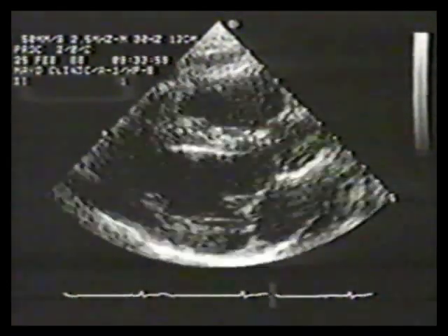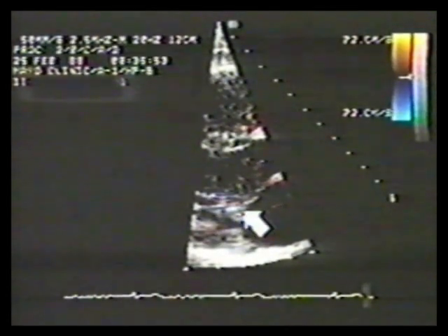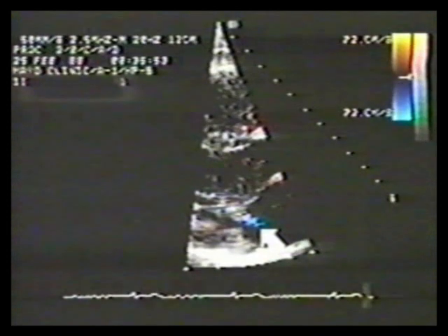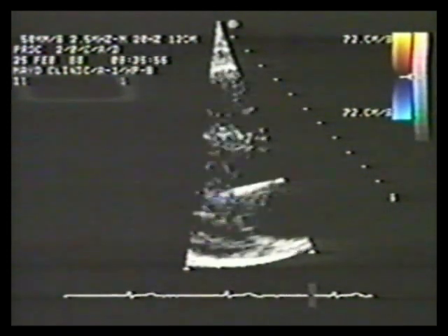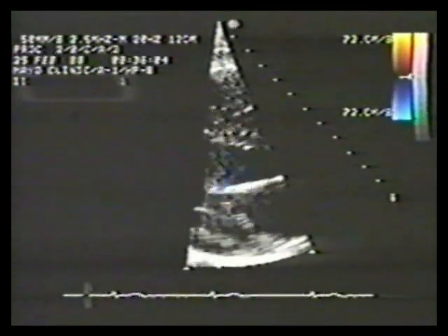In this parasternal long axis view, the mitral leaflets appear mildly thickened. In this freeze frame with leaflets closed, the color signals of mitral regurgitation occupy a very small portion of the left atrium — an example of mild mitral regurgitation. In another patient with an apex-down four-chamber view, blue signals indicate mild mitral regurgitation, while red signals in the atrium originate from the paraseptal pulmonary vein.